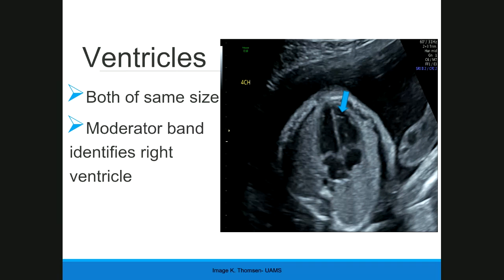So this is an image from UAMS. So here's our spine back here. So we're seeing the spine. This is the left side of the spine. So this is a cross-section view of the aorta. We know that in normals, which I'm going to give you, I'm not going to give you a bunch of abnormals because we'll talk about it and know what you should look for sonographically, but it's very hard to determine an abnormality based on a single or even a couple still images. It's really not beneficial unless you're scanning in real time. So think of normal for the time being.